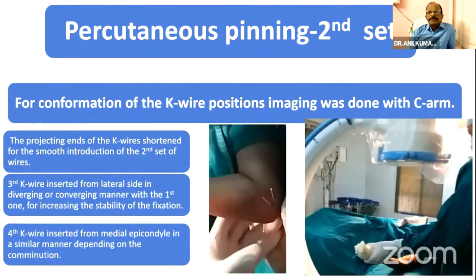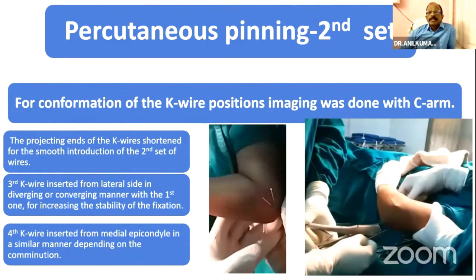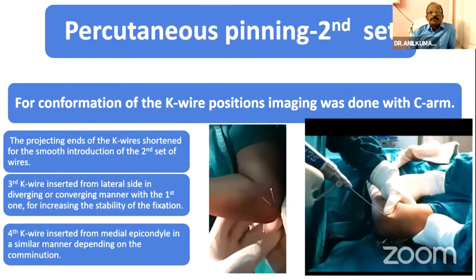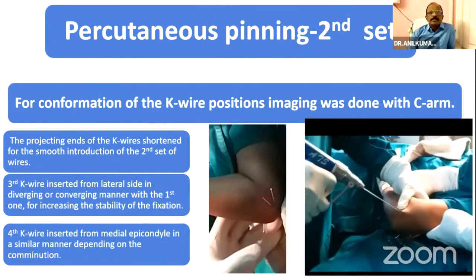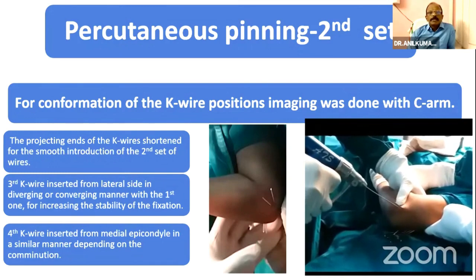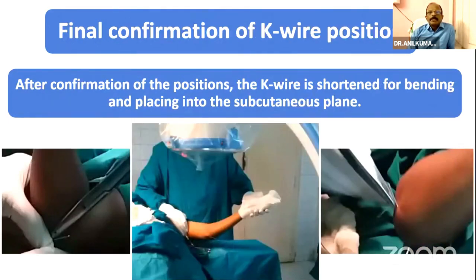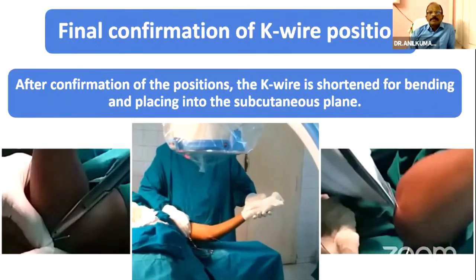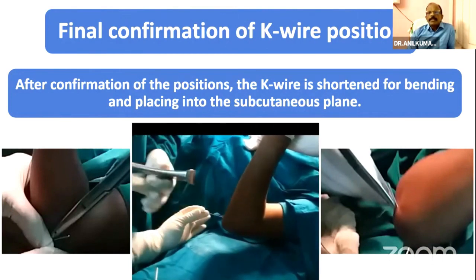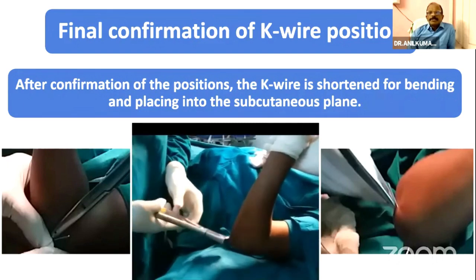After the percutaneous pinning of the first set, for confirmation of the K-wire position, imaging was done with the C-arm, and the projecting end of the K-wire was shortened for smooth introduction of the second set of wires. The third wire is from the lateral epicondyle and the fourth wire from the medial epicondyle. The final confirmation of the K-wire positions was checked. After confirmation of the position, the K-wire is shortened and placed into the subcutaneous plane.